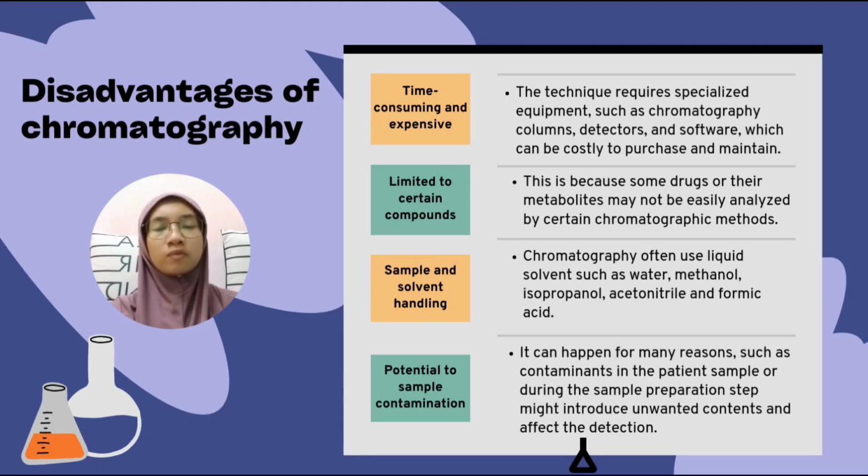Chromatography can be time-consuming and very expensive. The technique requires specialized equipment such as chromatography columns, detectors, and software, which can be costly to purchase and maintain. Additionally, chromatography testing often requires a high level of expertise and training to perform correctly, which can be time-consuming and expensive.